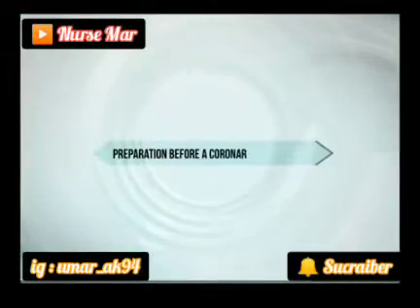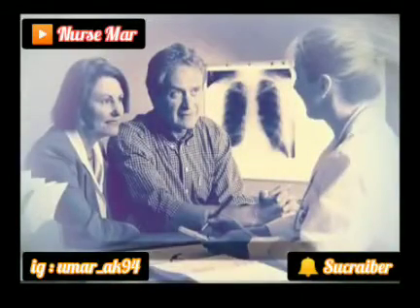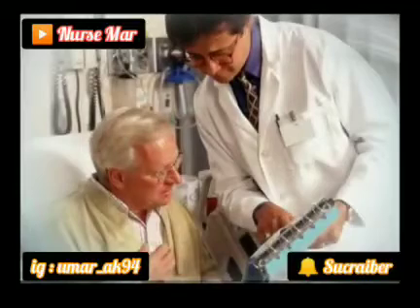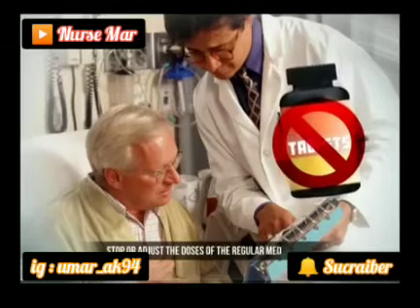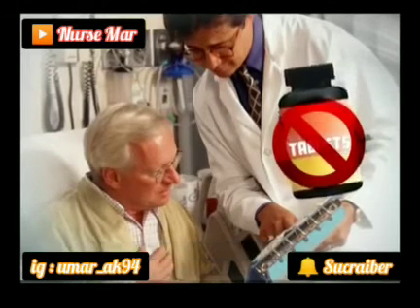Preparation before a coronary angioplasty. Follow the instructions regarding the intake of medications as directed by your doctor. In preparation for the coronary angioplasty, your doctor may stop or adjust the doses of the regular medications several days prior to or on the day of the procedure.